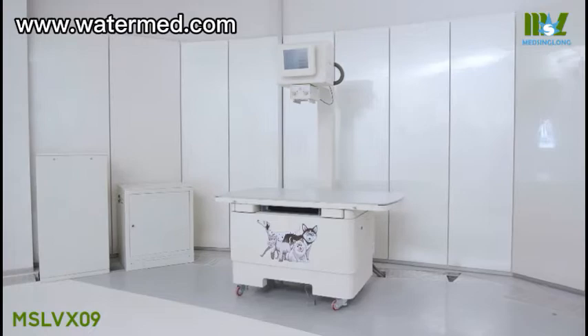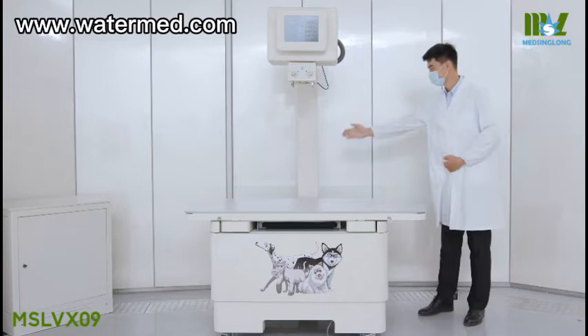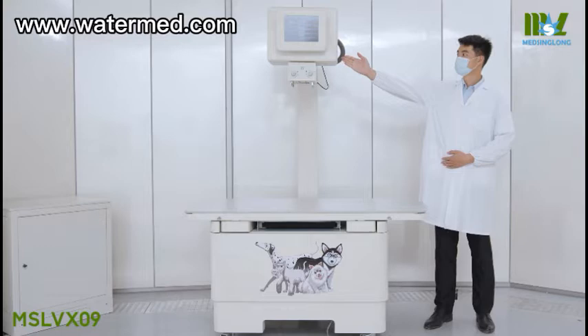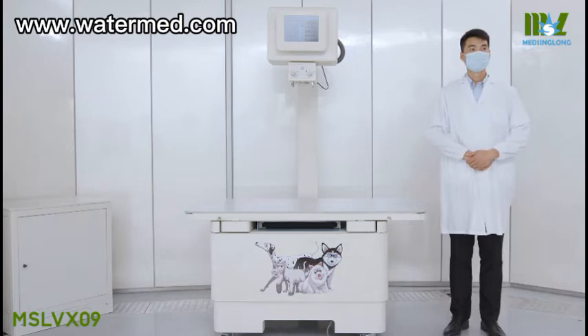Let's take a look at our equipment. The floor-mounted tube stand that houses the monoblock curve generator and the tube offers the most space-saving solution for any clinical environment. We use an advanced dynamic flat panel detector to manage not only radiography but also fluoroscopy.